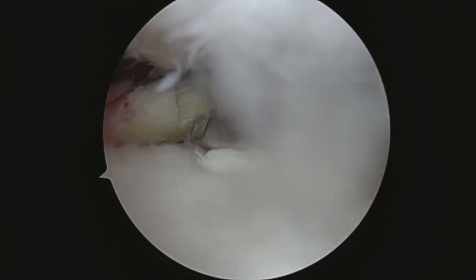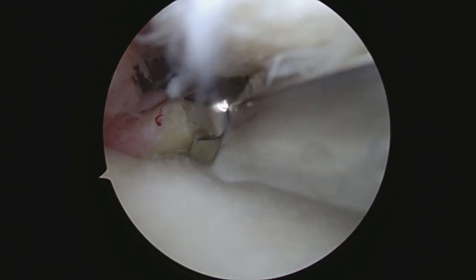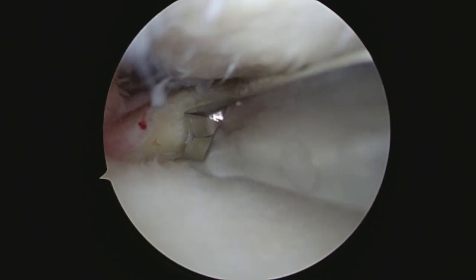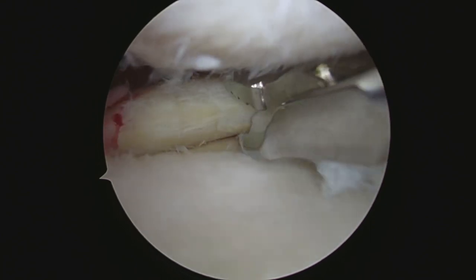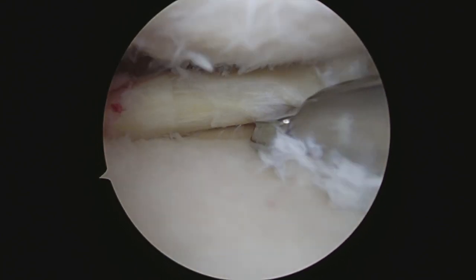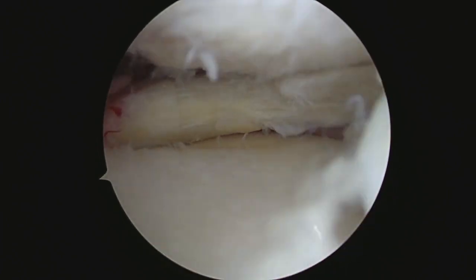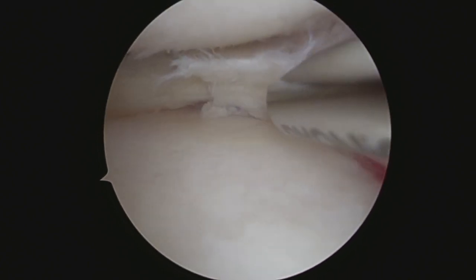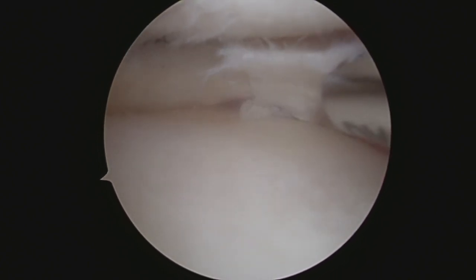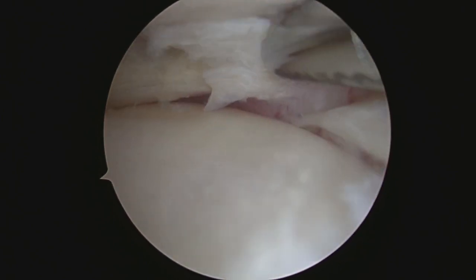Okay Roselle, I'm just starting from the very back to get a little bit of that normal meniscus, because you need to have a smooth transition from normal to where we take the tear off. So I'm just trimming down your posterior horn so that I get to the apex of the tear, which is going to be more to the right of the screen here. As we get some trimmings like that, we're going to pull this out and flush them out with this cannula. We got some of that biting done in the posterior meniscus. I'm going to use a shaver to take in whatever is loose, and then we'll continue with the biter.